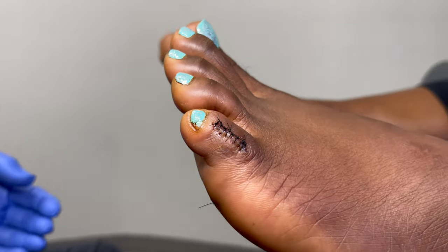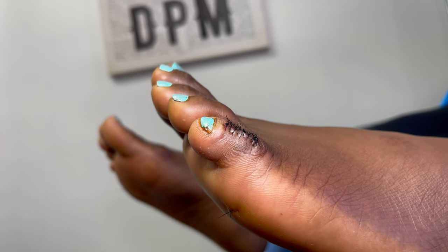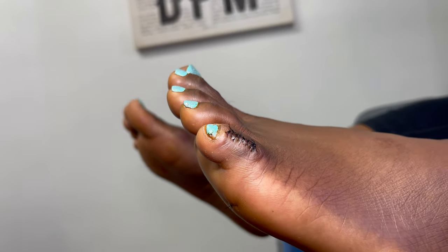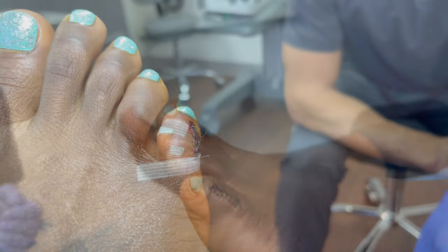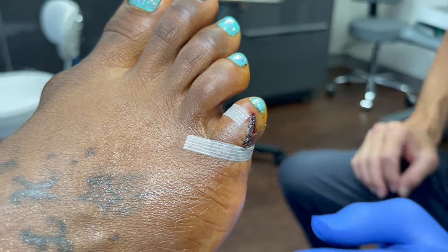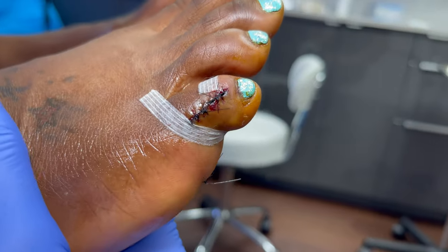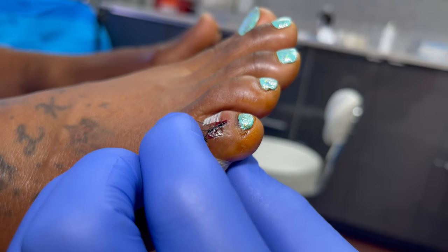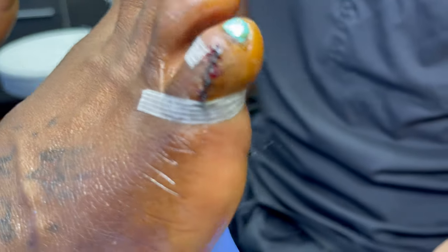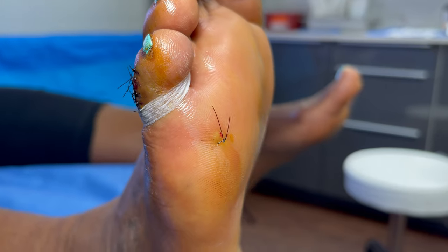Patient walks in, walks out — can get back to daily life activities. Work tomorrow, not a problem. Taking a look at the right foot, same thing. We use a little steristrip, and we're going to implement this for about three weeks. There's that one suture on the bottom — and that's it.